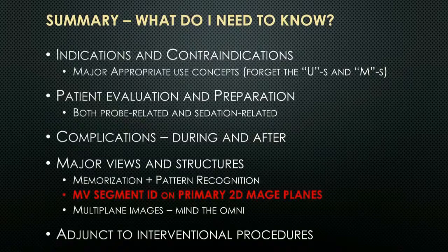Platelets, I've heard people say, I won't do a TEE less than 50. Other more renegade colleagues will say, I'll do it at 20. I don't have too much of a problem doing it at 20 myself. But again, you will find people who say, I'll never do a TEE below 50.